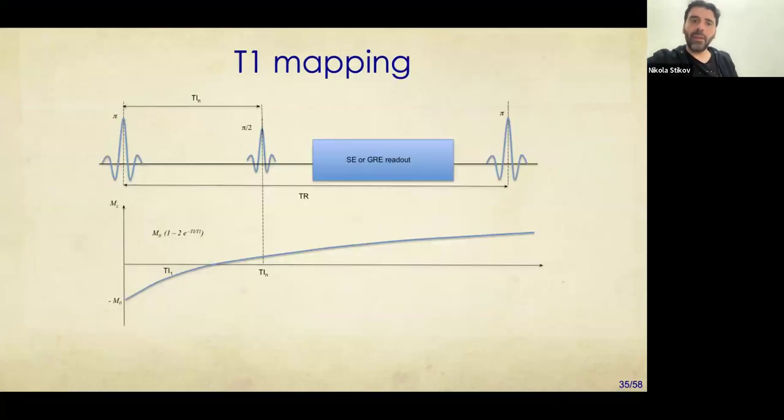Okay. Now, we are able to measure this T1 parameter. And the way that we do it is we tip the magnetization, but we do not tip it into the transverse plane. We actually tip it all the way down so that it goes from positive M0 to negative M0. And then we wait for it to recover. So I've tipped it from this orientation all the way down. And now the magnetization needs to slowly but surely get back to the regular equilibrium value of M0. While it is doing that, it's crossing through many points. So it will cross through 0 here, and it will cross through a non-zero value here.